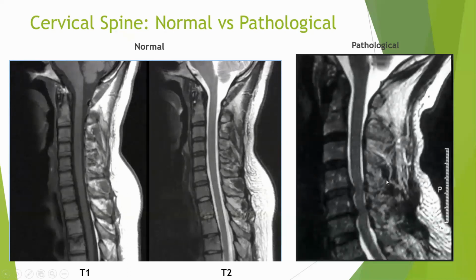Now, is this the first thing I'm looking at? No, I probably evaluate facets. I probably checked also in the X-ray. This is my second level of diagnostic measure. So by that time, this is a confirmatory process as to, okay, what I have seen, palpated, evaluated earlier, I am right on that. This is exactly what you are saying. Are you right or wrong? You can again honestly check this in an MR scan. This is exactly what you are noticing. All right.